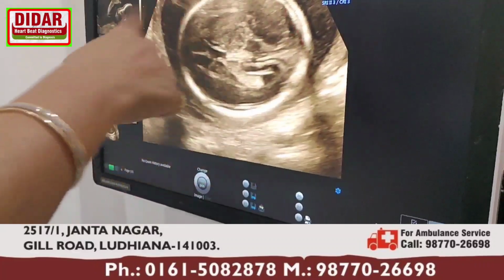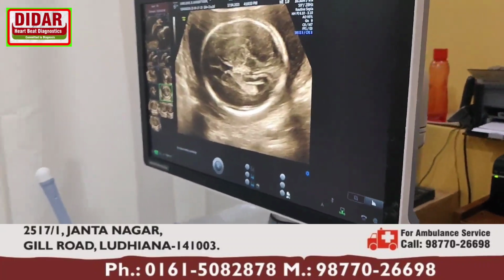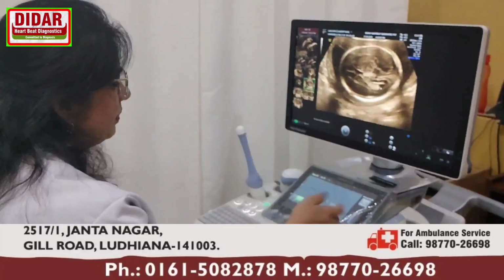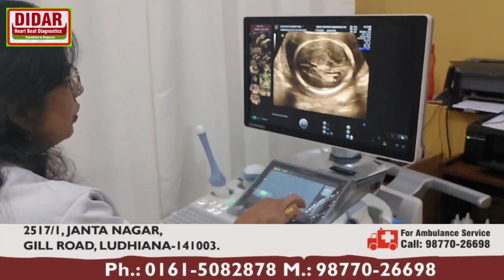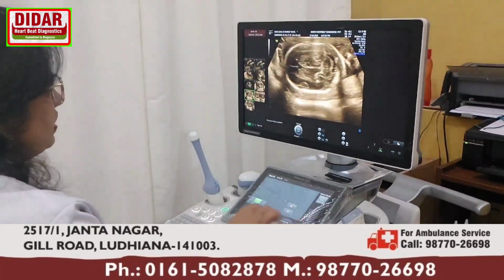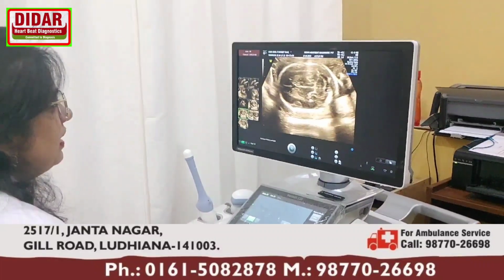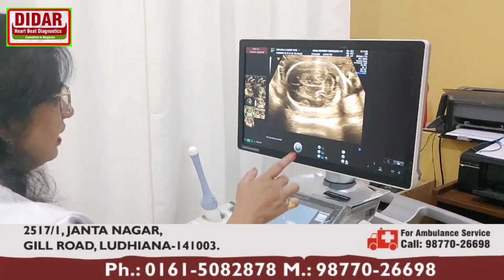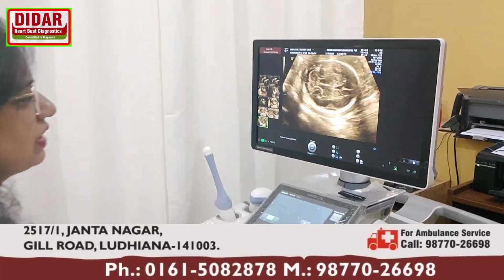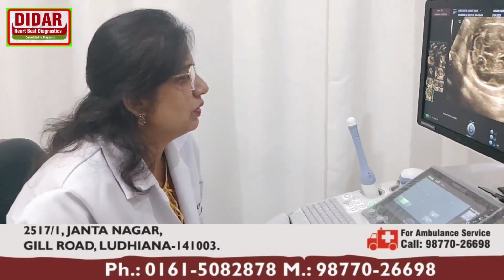Here in the fetal head we see many things. This blank space is the CSP, this is the ventricle, and we measure the size of the ventricle. If the pressure of CSF is more, then the ventricle width will be more. Then we see a very important structure here, the cerebellum, the fluid behind the cerebellum, then the thickness of the nuchal fold. There are many things, we see everything in detail. So a level 2 scan means we try to see each and every part of the fetus.